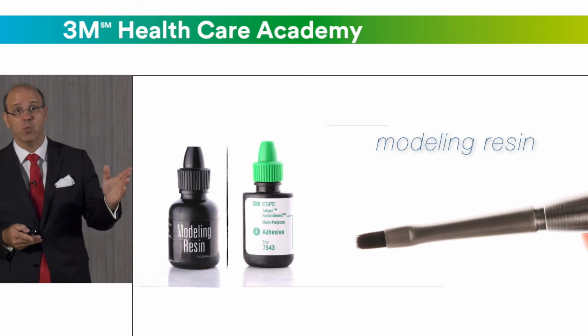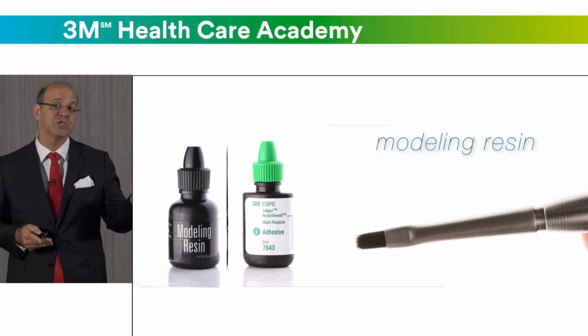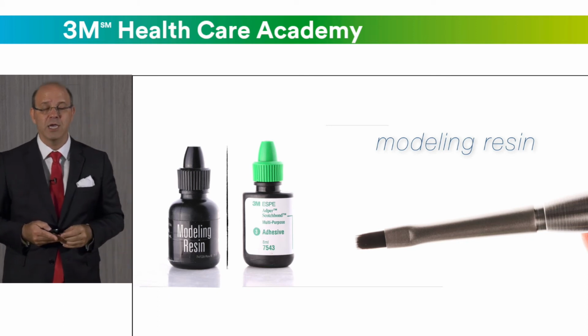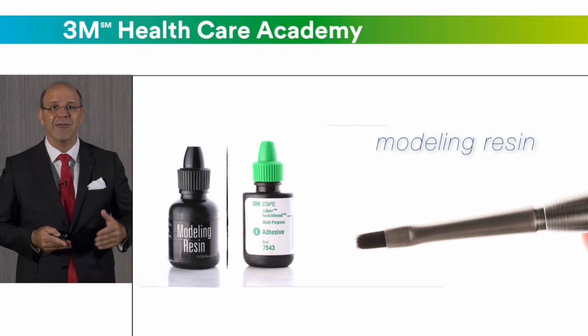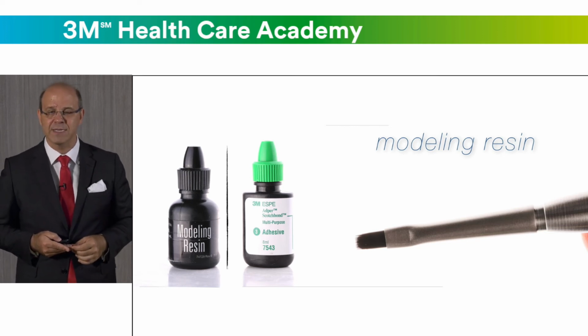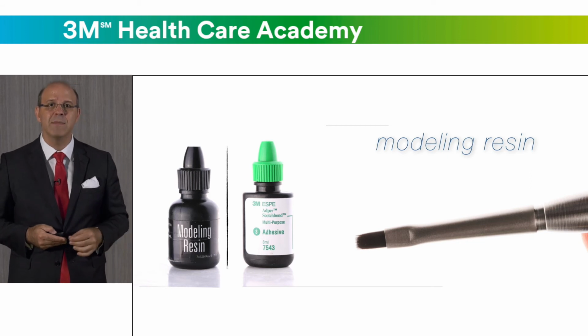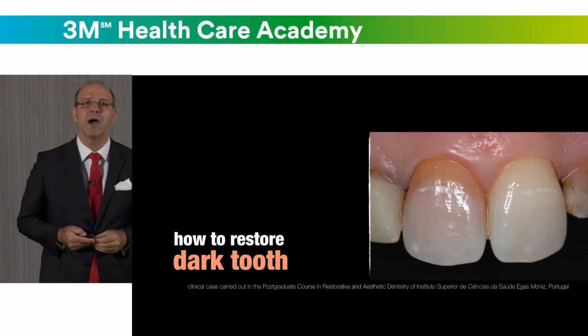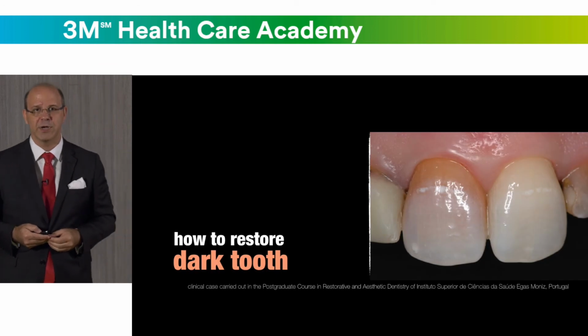Well, any brush you want, and you can also use the brush dry or wet. If you want to wet the brush, maybe these are the two materials you can use: a modeling resin or a pure adhesive without any kind of solvent. But even if you use some, please use a very, very small amount. Otherwise, you can damage your restoration, your composite.